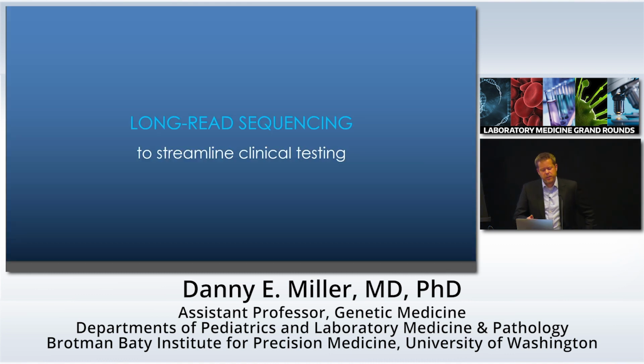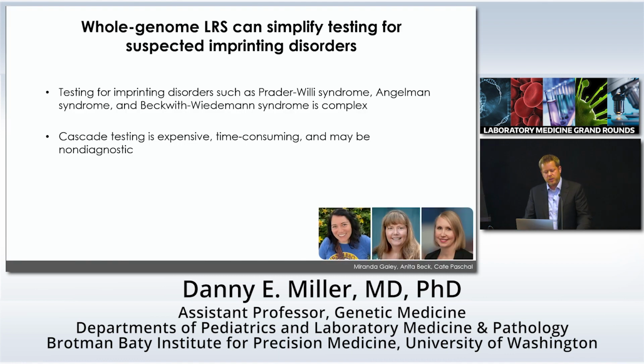I want to change gears a little bit and think about how we can use long-read sequencing as a single data source to streamline clinical testing, to make the clinical workflow much simpler and much quicker. This is work that we've done with Kate, who's here in the audience, Anita Beck over at Children's, and then Miranda Gailey, who's the lab manager in my lab. And the question is, how can we use whole genome long-read sequencing as a single test for suspected imprinting disorders?